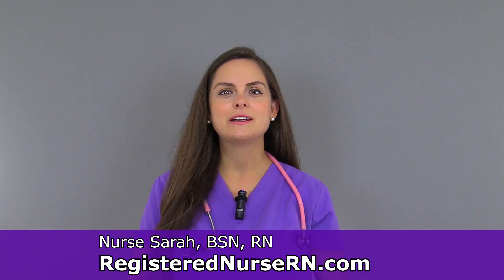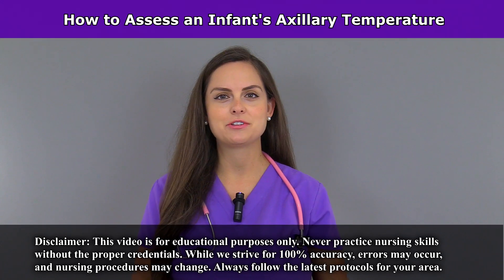Hey everyone, this is Sarah with RegisterNurseRN.com and in this video I'm going to demonstrate how to assess the axillary temperature in an infant.